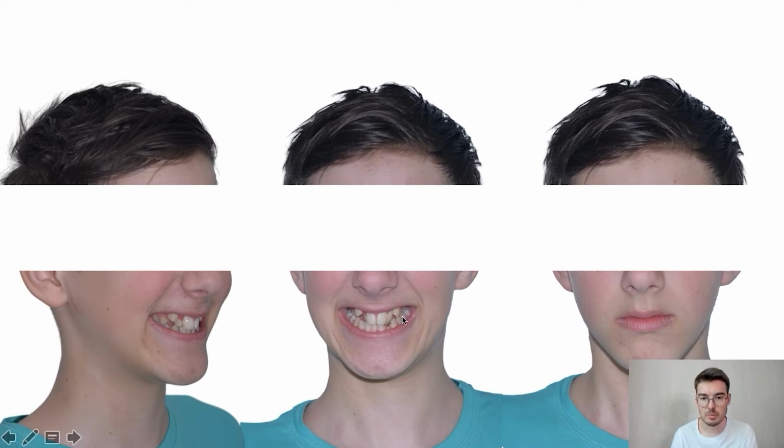Look closely at his buccal corridors. Teenagers often don't smile, especially those with uneven teeth. But this is not the problem. Let's take a look at another photo. You can see an elongated face.